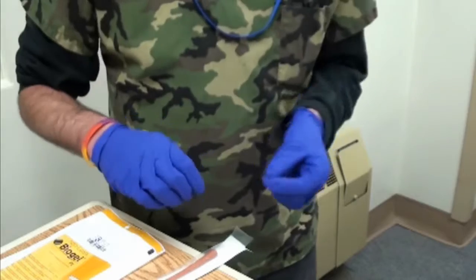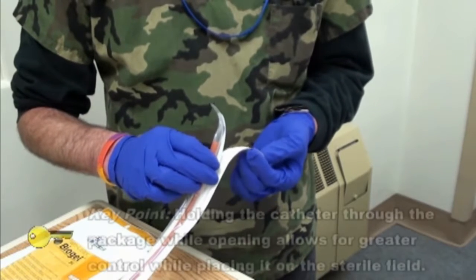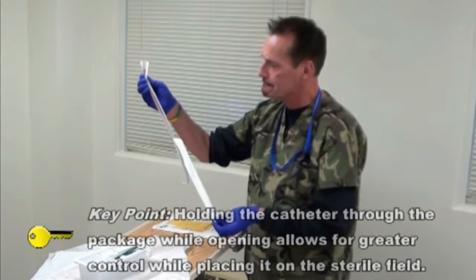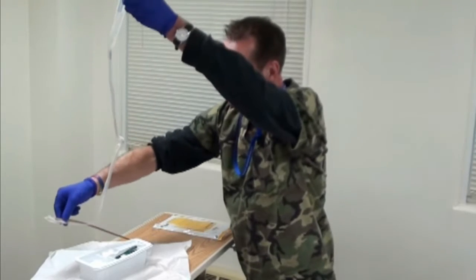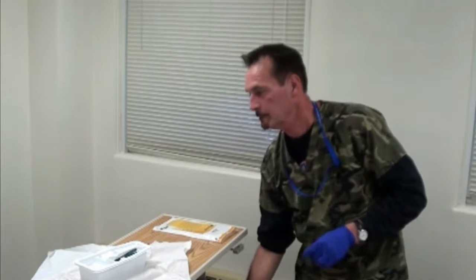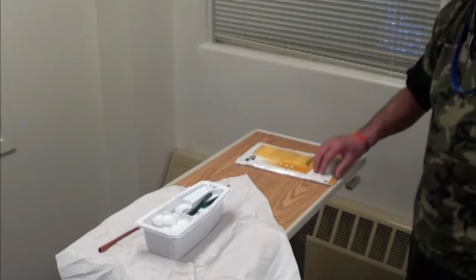Okay, I'm now going to open up my catheter package a little bit, and grasping the catheter right here, I'm going to peel back the rest of the packaging. Open it up and drop it into the sterile field. Now I'm going to remove my gloves so that I can put on my sterile gloves. Okay, I'm now going to open up my sterile gloves.